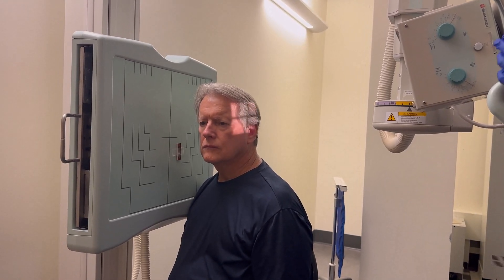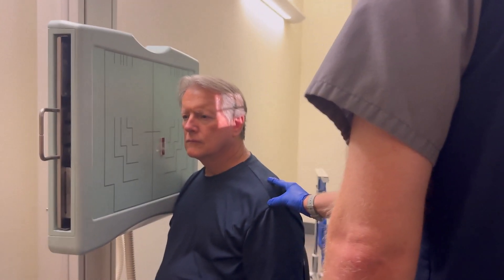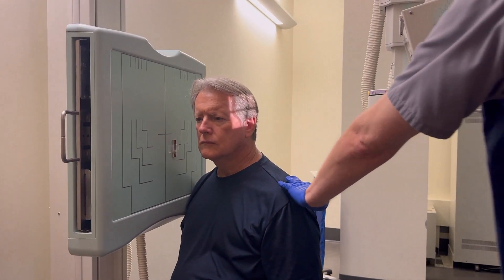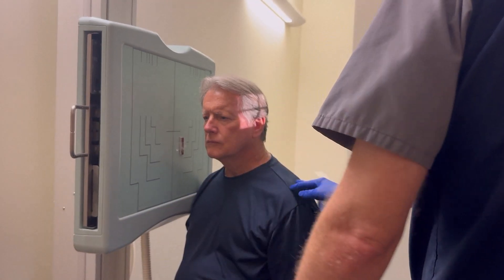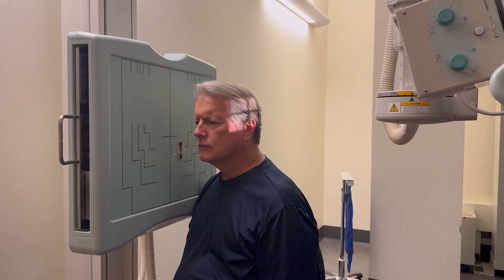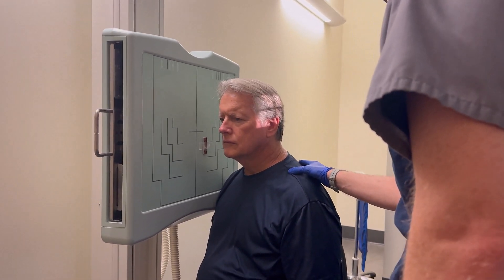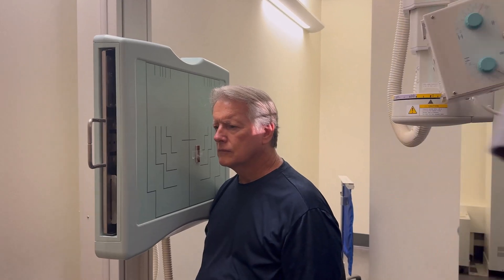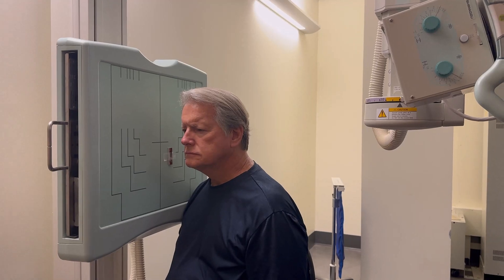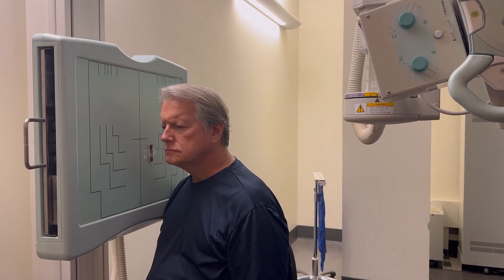Now we want 15 degrees of head rotation, so you're going to turn your head slightly toward the board. As he turns, you'll see that is moving my central ray projection on his head farther back. We need it to shift about an inch and a half from this upside joint, which kind of puts it near the upper outer earlobe. You don't want to be too far back because then you risk clipping the joint in the front. Set your teeth together so that your mouth is fully closed, and then expose on suspended respiration. Then we would do an open mouth view as well.